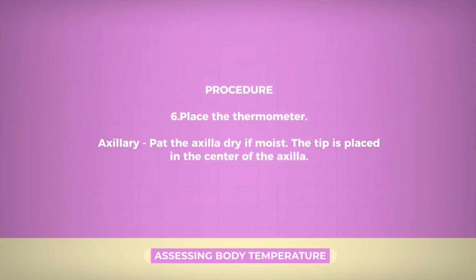For axillary, pat the axilla dry if moist, and place the tip in the center of the axilla. Drying the axilla prevents cooling effects from moisture and ensures accurate temperature reading.